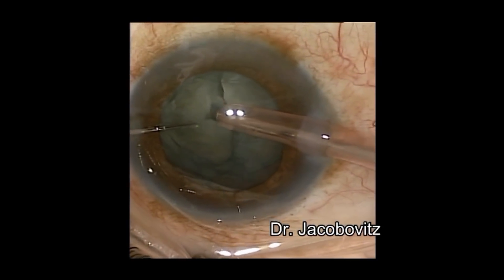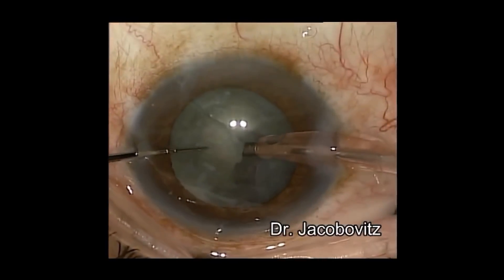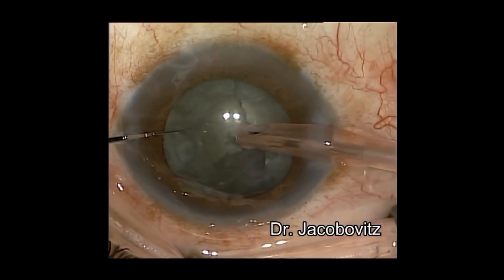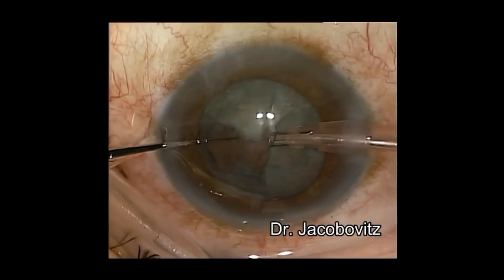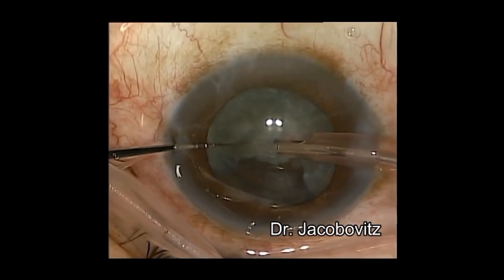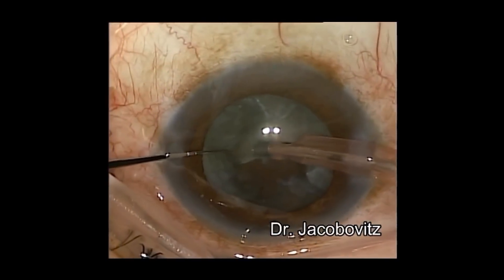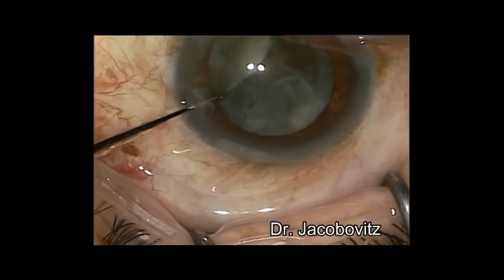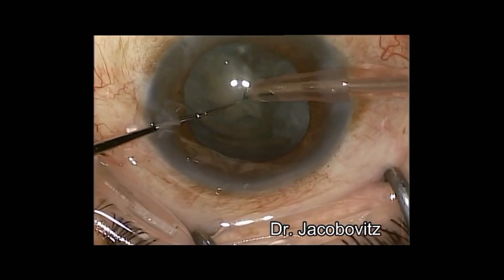In the quadrant step, I start with a vertical maneuver. Then, after retracting the capsular bag's rim, I go forward making a horizontal movement. There is then an alternating sequence of vertical and horizontal chopping. These maneuvers using the chopper are natural and precise, and nuclear fragments stay steady.